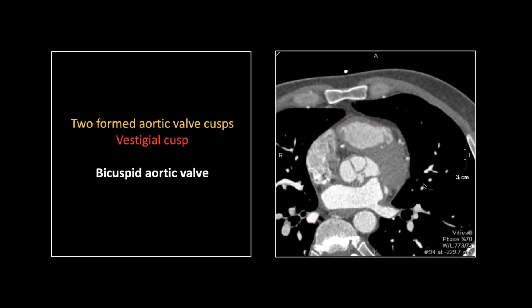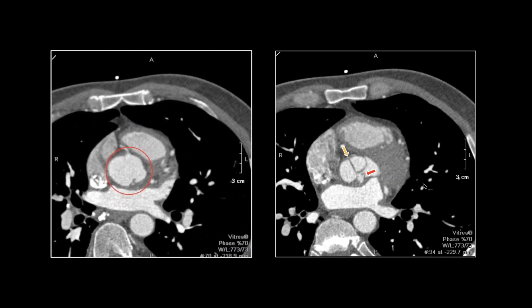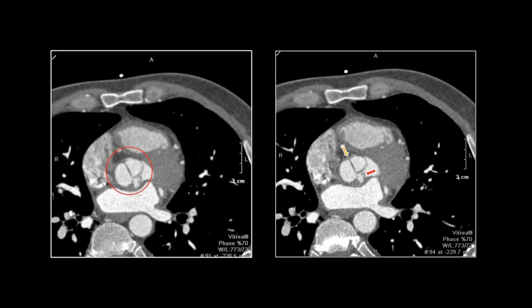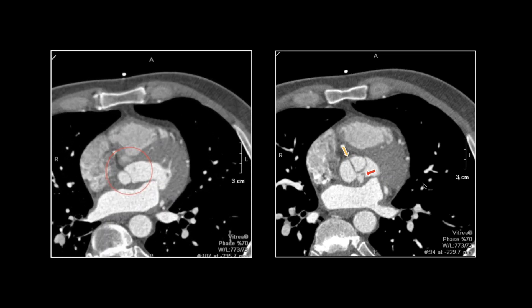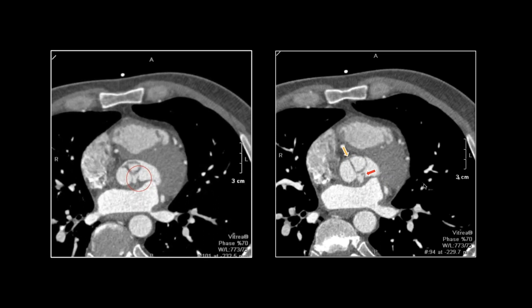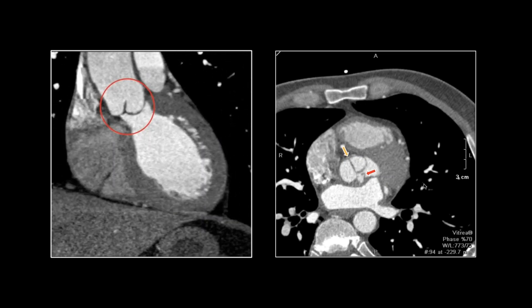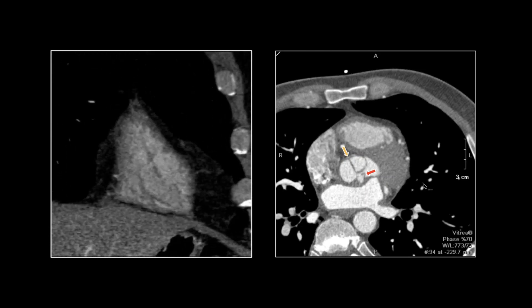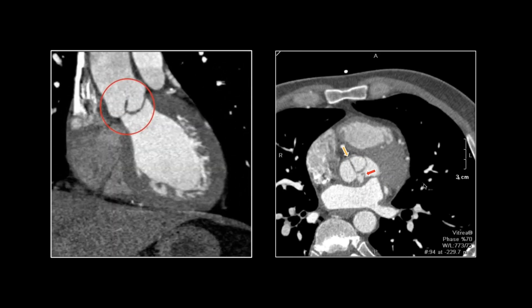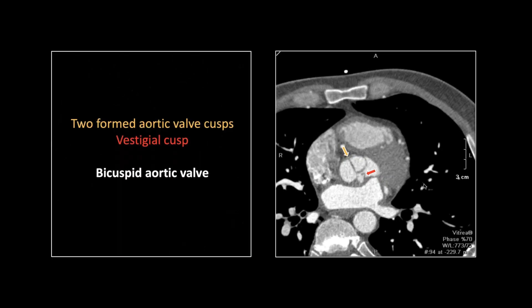Our next valve case is a bicuspid valve. You can see there are two normally formed aortic valve cusps and then there's this one little vestige here. On these gated studies you can often pick this up in bicuspid valves — there will be just this tiny little smidgen of vestigial cusp instead of complete absence. So there are the two normal cusps, and then there's that one posterior vestige. That is a bicuspid valve, which can be associated with a number of other abnormalities, probably most commonly coarctation.